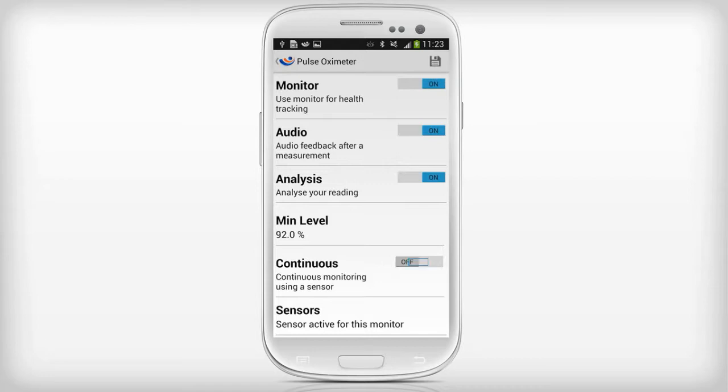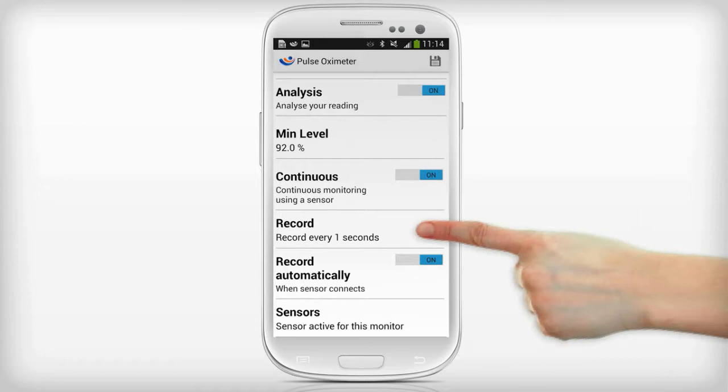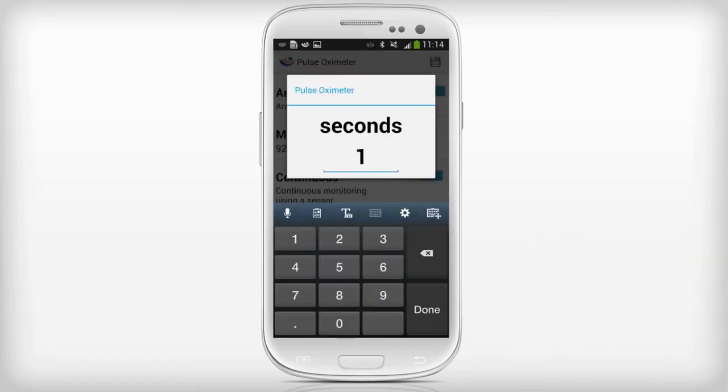Set continuous to on if you want continuous monitoring. Tap record to set the recording interval and type the corresponding number.